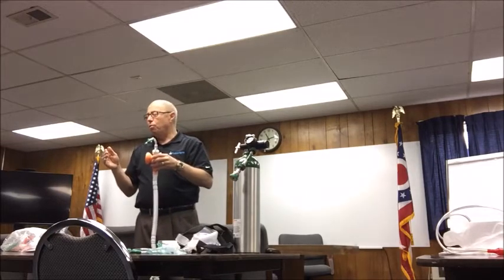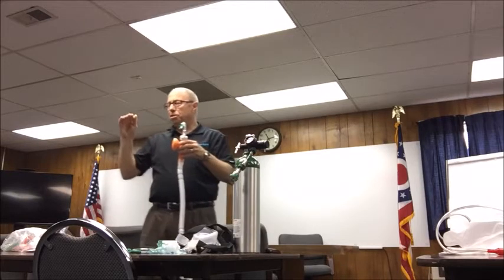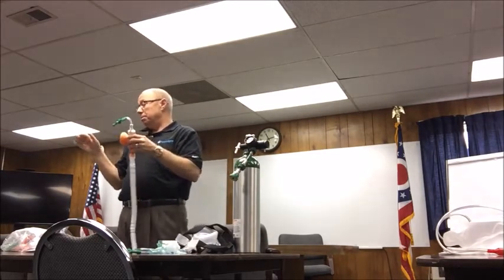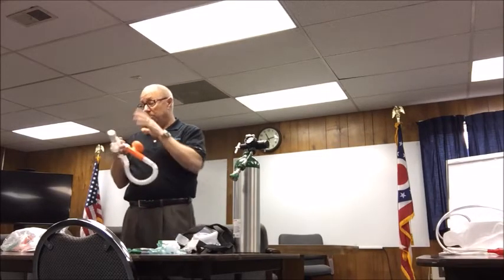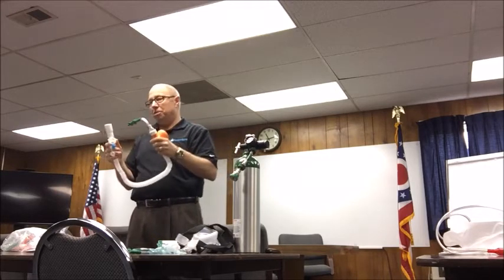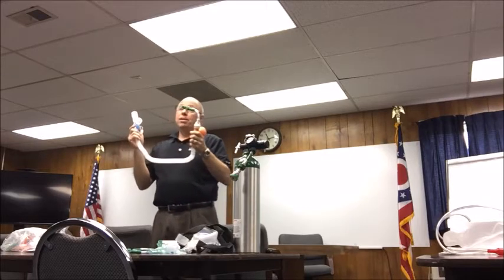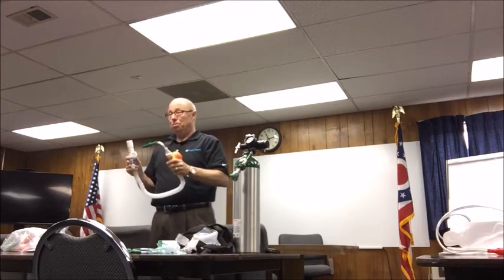You can see the waveform after you apply CPAP, and you can see if it's improved or if the patient's getting better. So it's real important to get a baseline using end-tidal. Now you're using the Capno line, right? Yes. Perfect. A lot of people think they can use the intubated line and there's too much dead space and everything else. One of the other advantages of using capnography is it's a diagnostic tool.